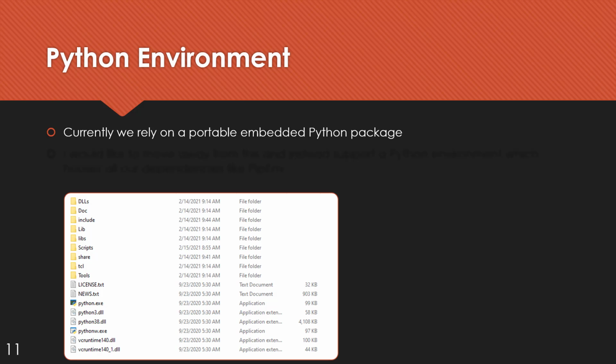However, if a more skilled developer wants to make BCPy2000 work with their current installation of Python, it's very difficult for them to reproduce what we have, and if they decide that they want to update certain components at any point, there's a risk that a newer version of some dependency will change basic functionality.